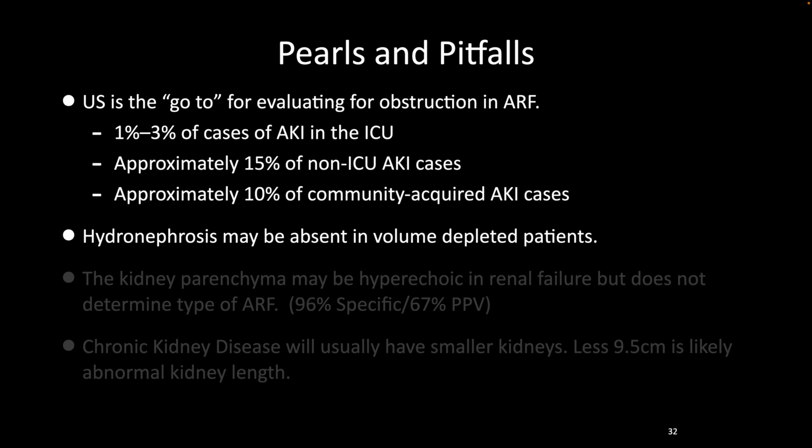And that is what I typically do in my practice to evaluate for hydronephrosis if it is absent when I suspect it to be there. Now, that is independent of acute renal failure patients, but a lot of times when we have acute renal failure patients, we do give them fluids, and it should be a consideration that you reevaluate them to see if hydronephrosis has developed, if initially not present.